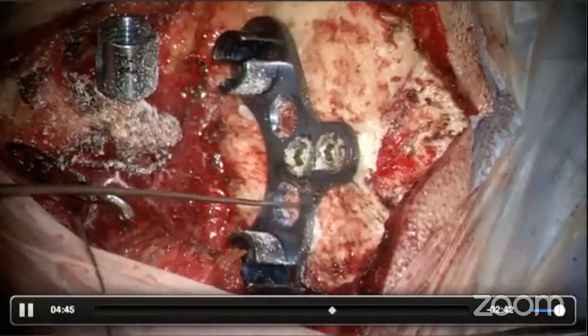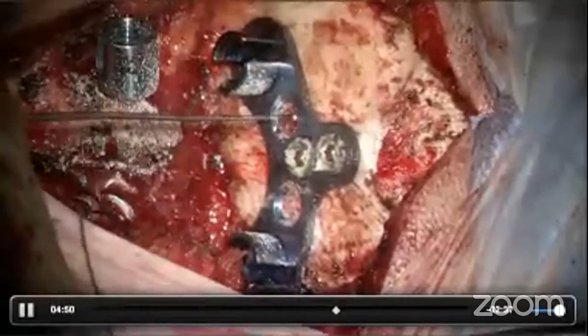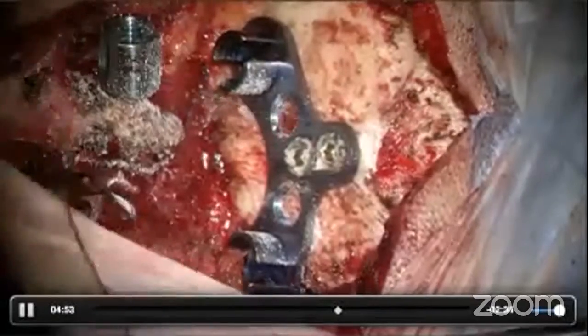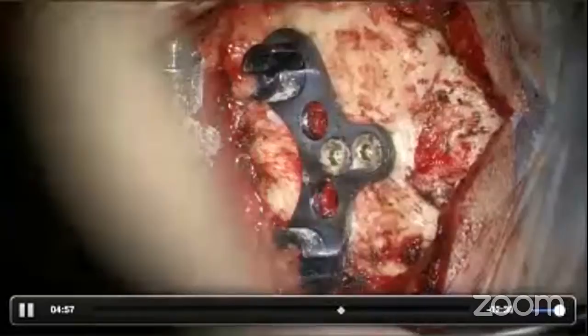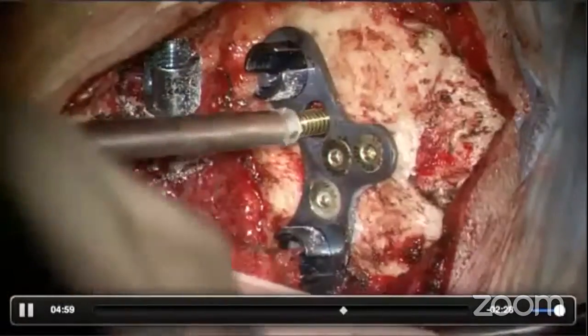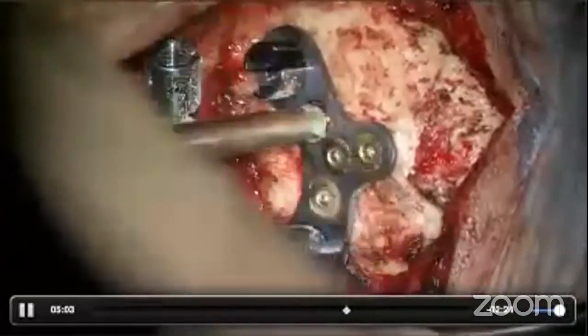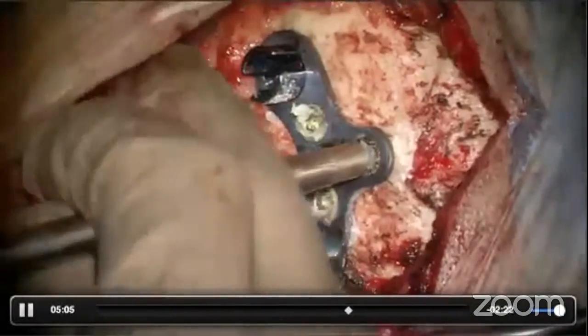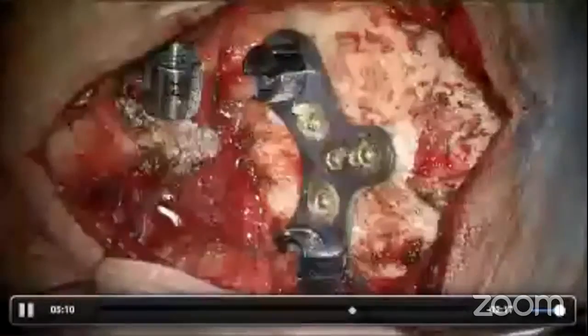The rest of the steps are the same. The screws here are smaller, and you might just drill one cortex and reach a soft endpoint. We have used the 8 mm screws in this case. Finally, tighten all the screws so that the plate sits flush on the bone surface.